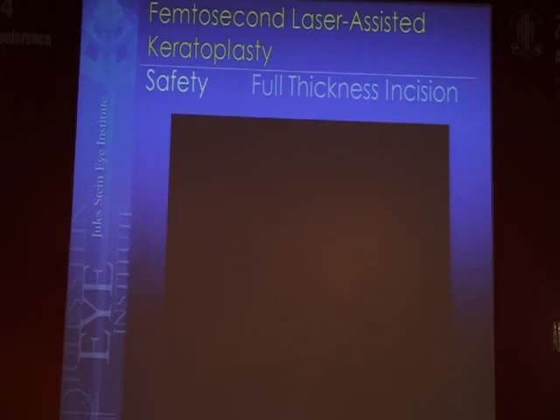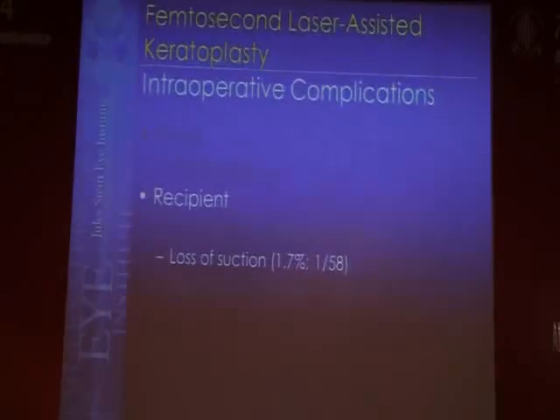So we had a full thickness trepanation. When I took off the suction ring, the chamber collapsed, and I had to suture the wound in the laser suite before transporting the patient to the operating room, which is in a different building. I was lucky that that's all I had happen. If you've got an open eye with pressure on it with that suction ring, you could risk an explosive choroidal. You do not want that to happen anywhere, especially in a non-sterile environment such as a laser suite. So that was one of the 2 times that's happened.